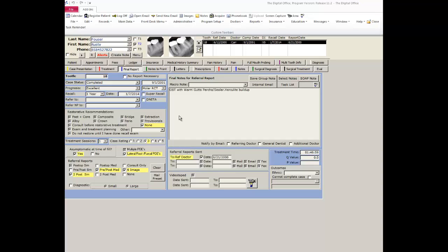When a case is completed, the only page that needs to be filled out is the patient's final report page. Once the values are entered on this page, there is a section here where it says notify by email. You have the option to notify the referring doctor, the general dentist, and the additional doctor as you choose fit.